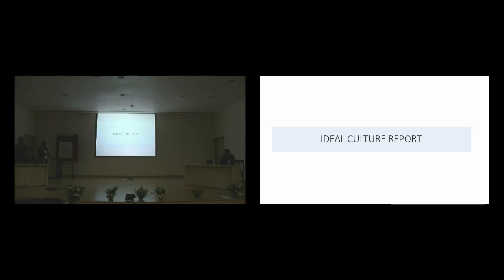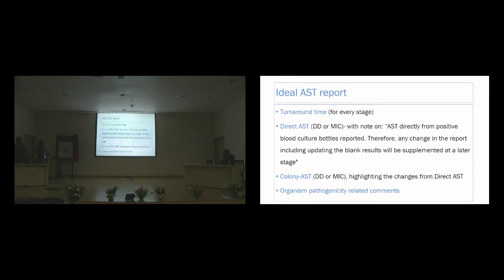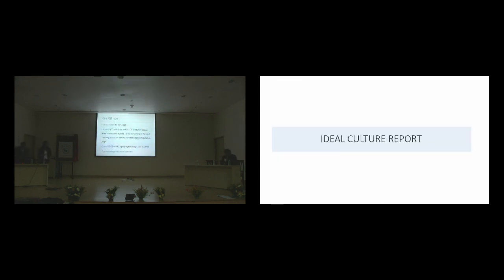Sir, this is the last part of the session. Right. So I'll just say one thing about it. Harshul, you don't have to feel bad about the comment that it doesn't give the actual MIC; it gives a virtual MIC definitely. On many occasions it doesn't give you the exact figure, it says more than this and less than this, so we don't know how much less or how much more. So all the systems have some kind of virtuality.